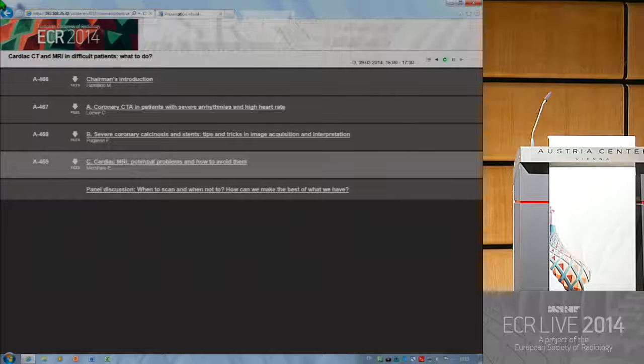Regarding the imaging of the stent in the appropriateness criteria of 2010, to image a stent, it must be in the left main coronary artery, and the stent diameter must be above 3 millimeters. But this must be done for an asymptomatic patient. My question: why do I have to scan asymptomatic patients? Why do I have to scan patients with no symptoms?